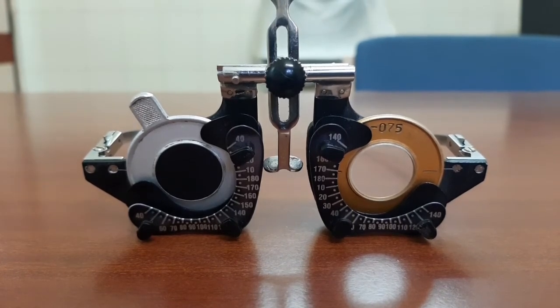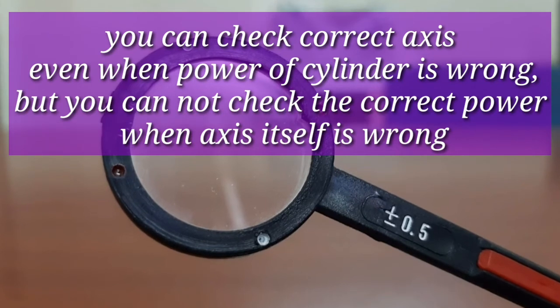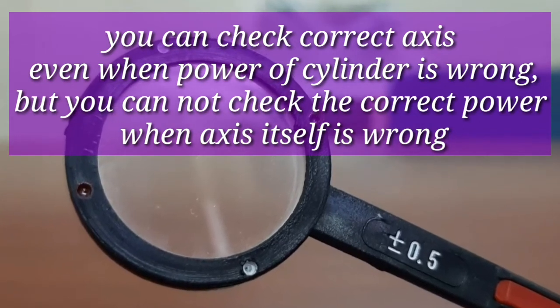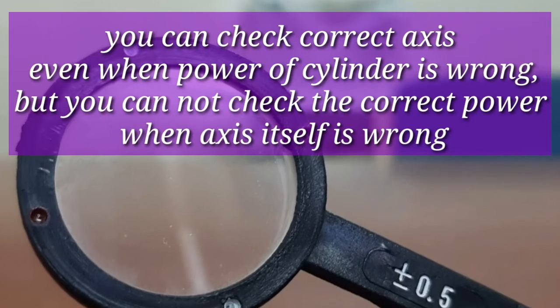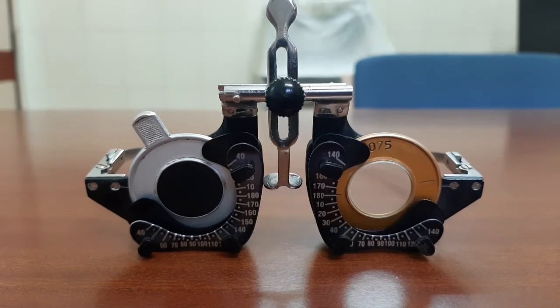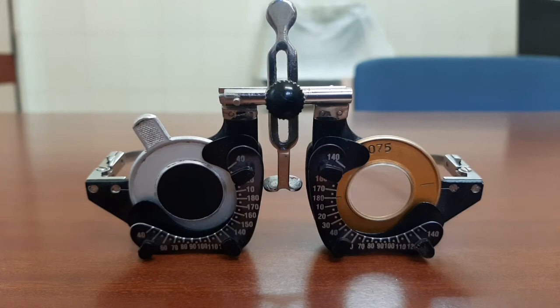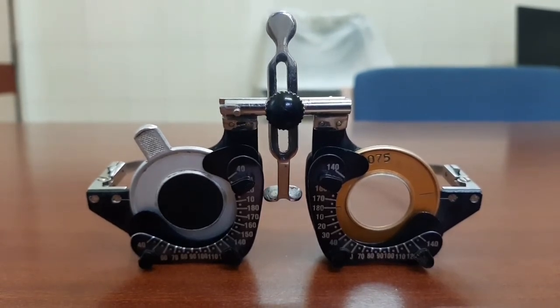Whenever you want to use the Jackson's cross cylinder, always check for the axis first, then go for checking the power. To refine the axis, suppose the patient has accepted minus 0.75 cylinder at 180 degrees. Ask the patient to wear the correction, occlude the right eye, and ask the patient to look at the Snellen chart two lines above the best corrected visual acuity. Suppose this patient is seeing 6/6 with minus 0.75 cylinder — ask the patient to concentrate on one of the letters of the 6/6 line.